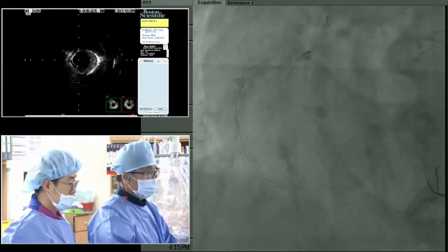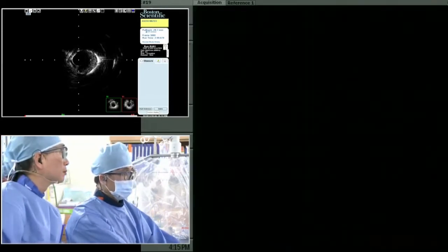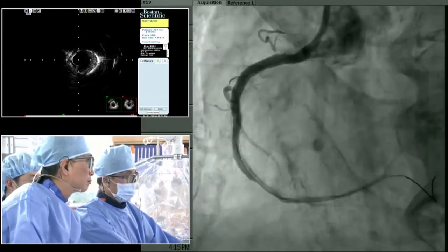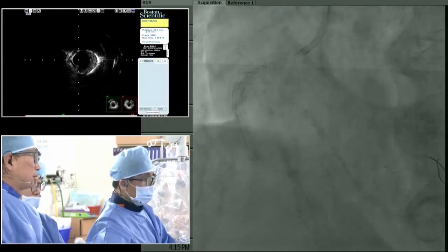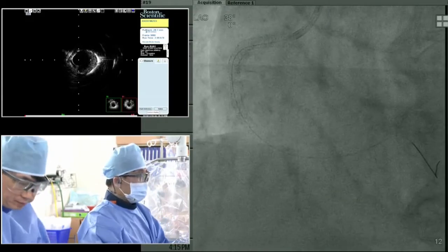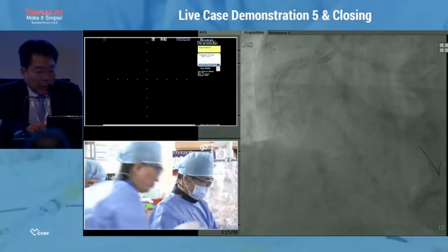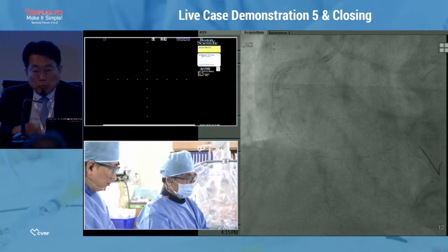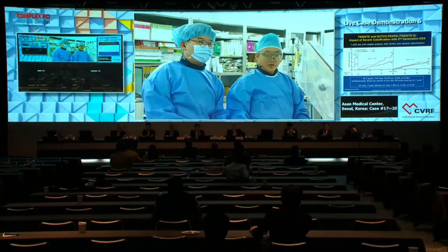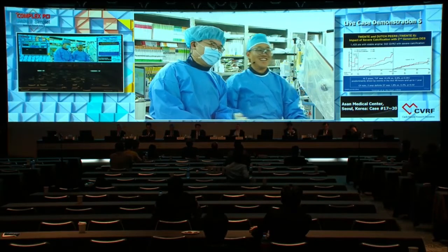Okay. So we check the angio. Angio, ready? Wow. Great. I like it. You know the IBIS? Yes, after that I will check the findings and finish the procedure. Okay, we will be back after the IVUS evaluation. So Dr. Bach, can you hear me? Okay. Is this the last case? Yeah, this is the last case. All right. Long journey.